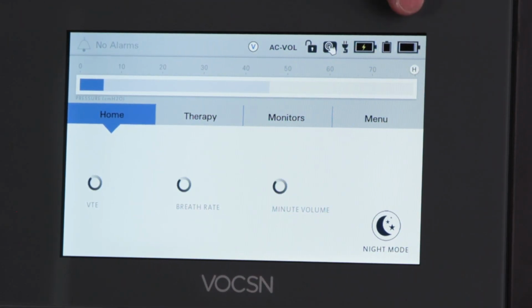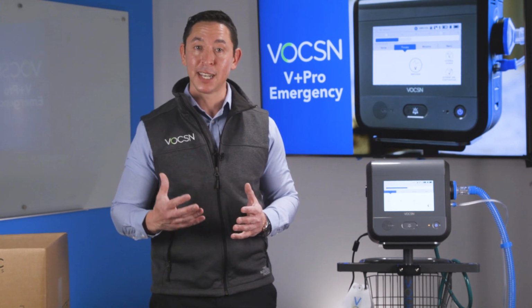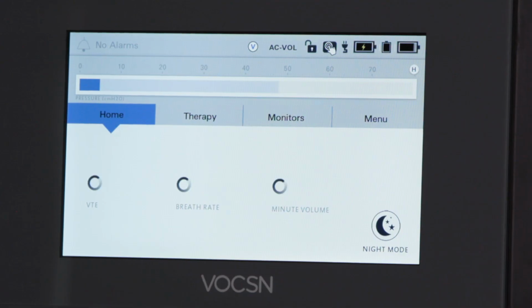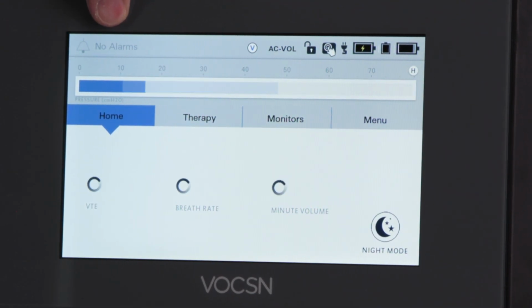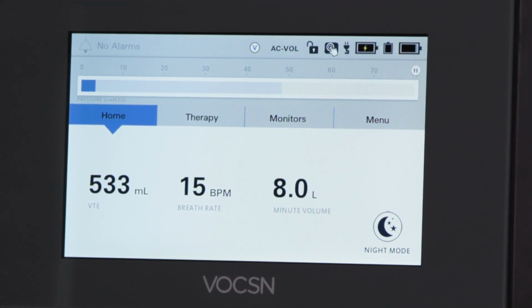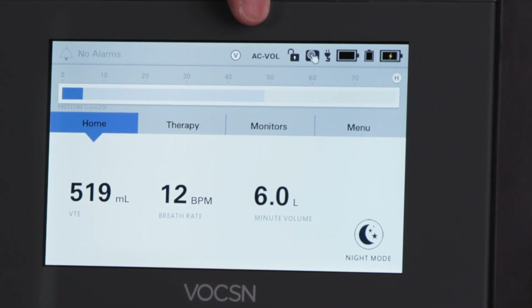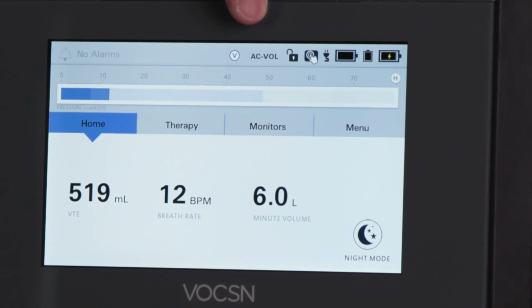So what I'd like to point out is this top row up here. That's what's called our status bar. As a clinician, that tells me everything I need to know about this device when I walk into a room. For instance, I can see where it says no alarms. That just tells me I did not have any alarms. As I move across the status bar, I see that V icon. That lets me know that ventilation is running. Next to that, I see AC volume. That just lets me know what mode of ventilation I'm currently in.